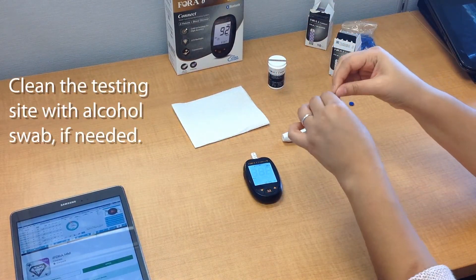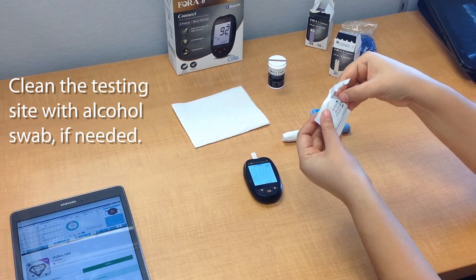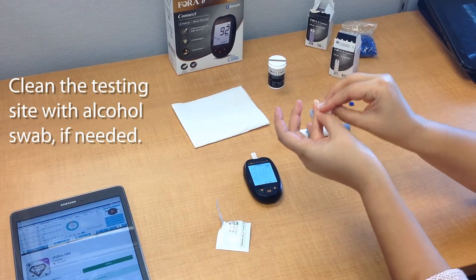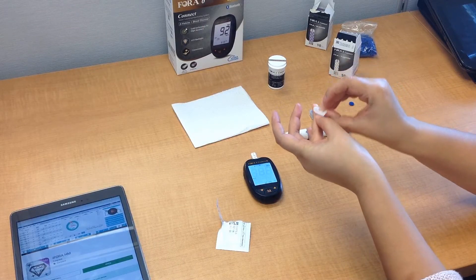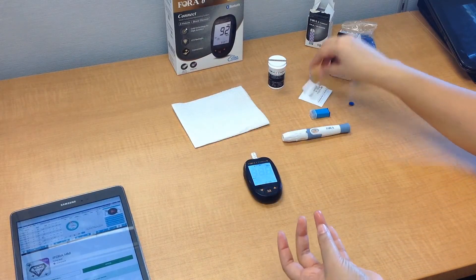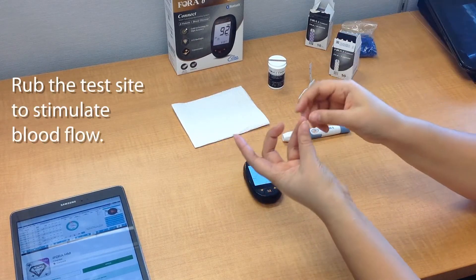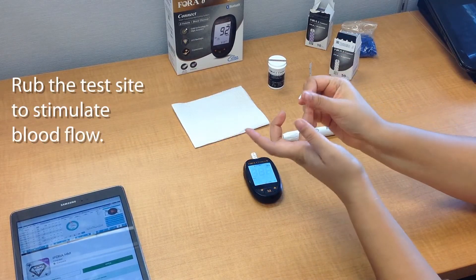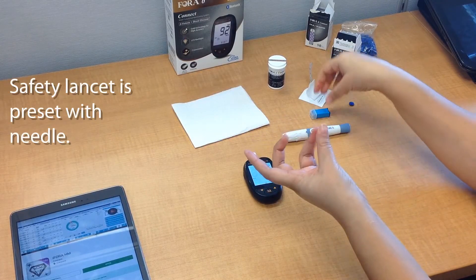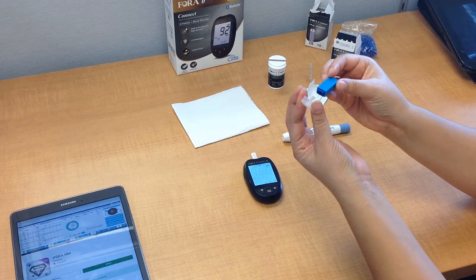Now let's go ahead and take the alcohol swab and clean the testing site. You can skip this step only if you've just washed your hands and haven't touched anything so there's no contamination. Otherwise, you'll need to do this to make sure that there's no dirt, lotion, or oils. Go ahead and let it air dry for a little bit, and then rub the site to make sure that there's enough blood that comes to the area. If you're using a safety lancet, no preparation is needed like with the lancing device — you just take off the cap and then puncture. The needle is already preset.